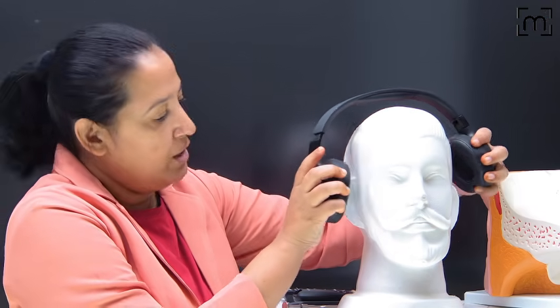Now coming to speech audiometry. There are two types of speech audiometry. First is speech reception threshold, SRT. Here also I am putting just a headphone, no vibrator, on the patient. Suppose I am testing this ear.